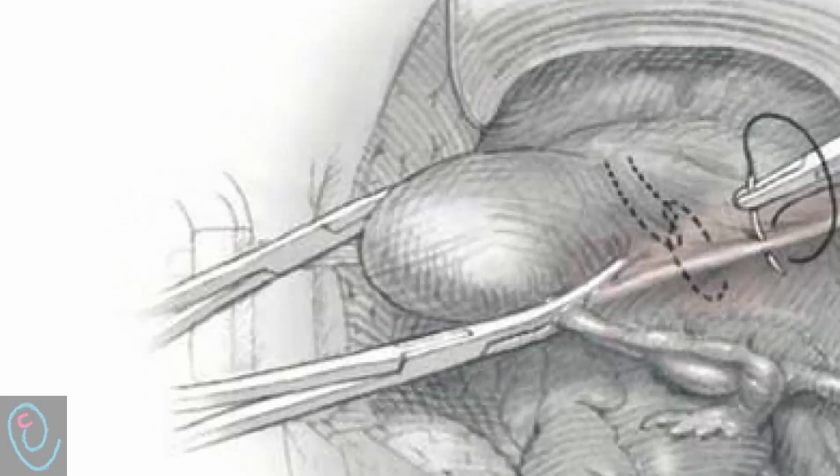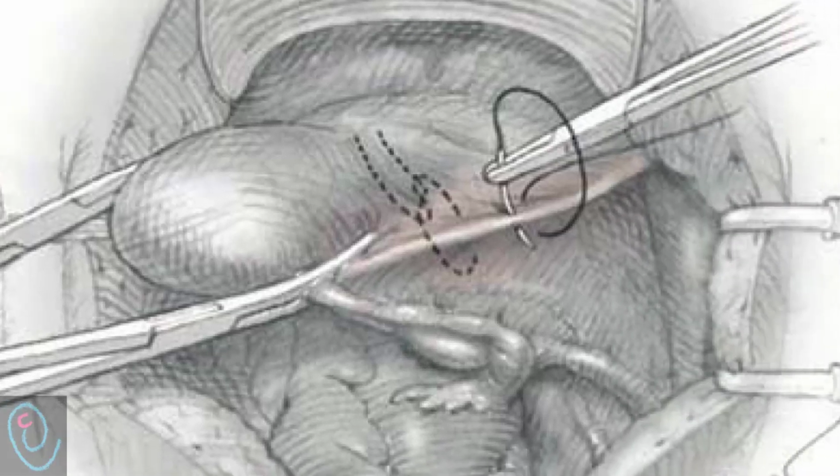Curved clamps are placed immediately lateral to each uterine cornu to permit uterine manipulation. Division of the round ligament at its midpoint. This provides entry into the retroperitoneal space for ureter identification and access to the uterine artery and the cardinal ligaments.